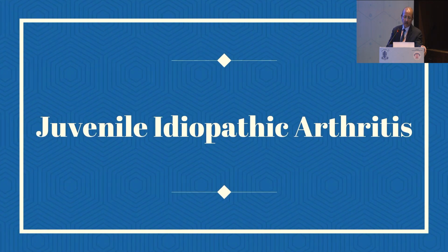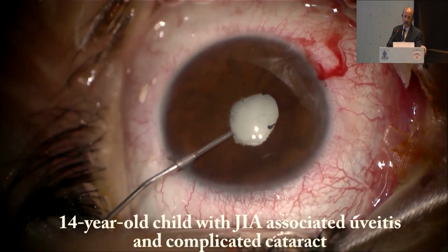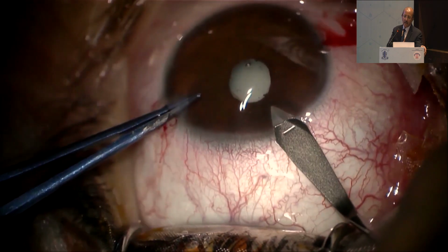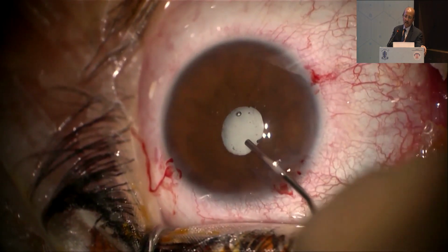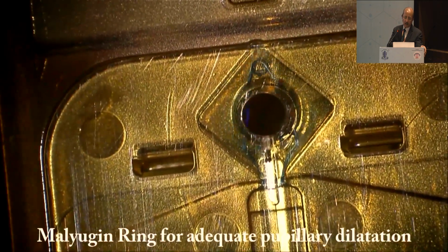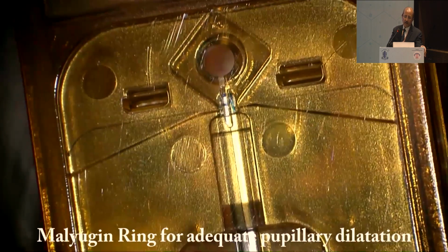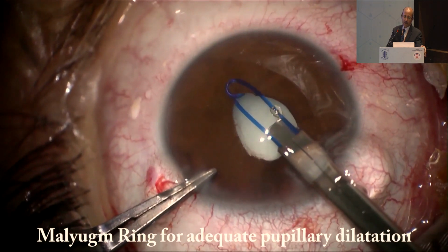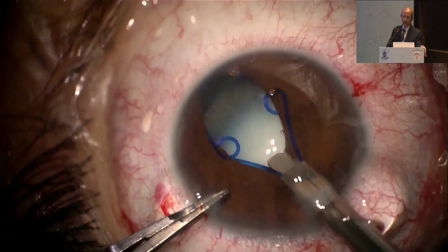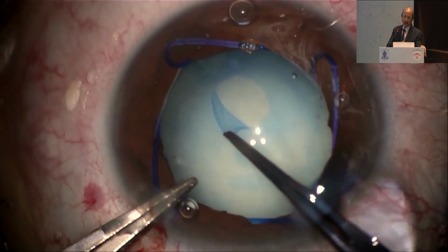And then comes another child with juvenile idiopathic arthritis having 360-degree posterior synechiae. In such a situation, synechiotomy is done and then place a Malyugin ring or any other device to adequately dilate the pupil. But we must know how to place this Malyugin ring. This is easy to place, not difficult.